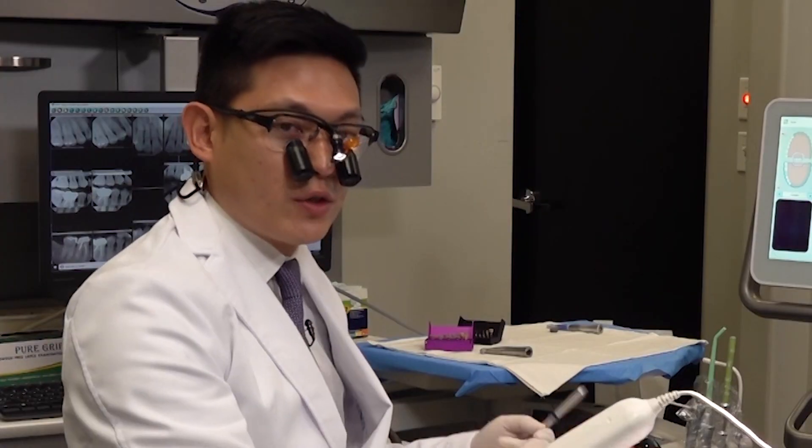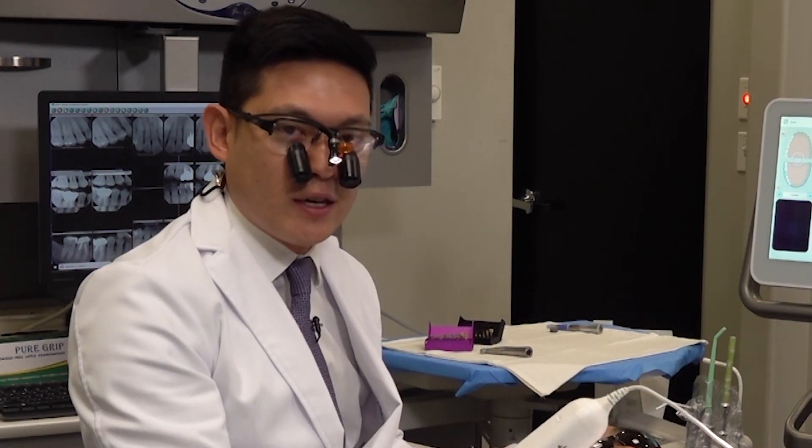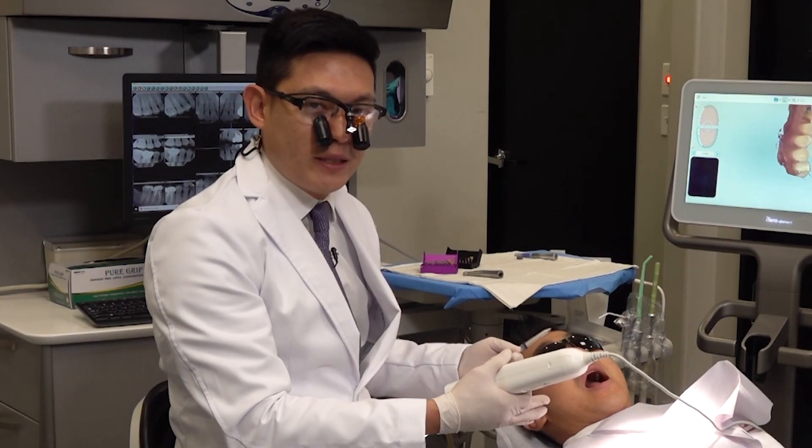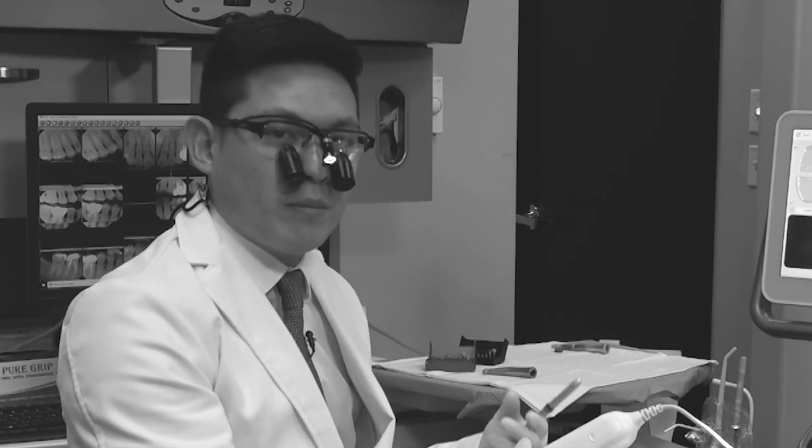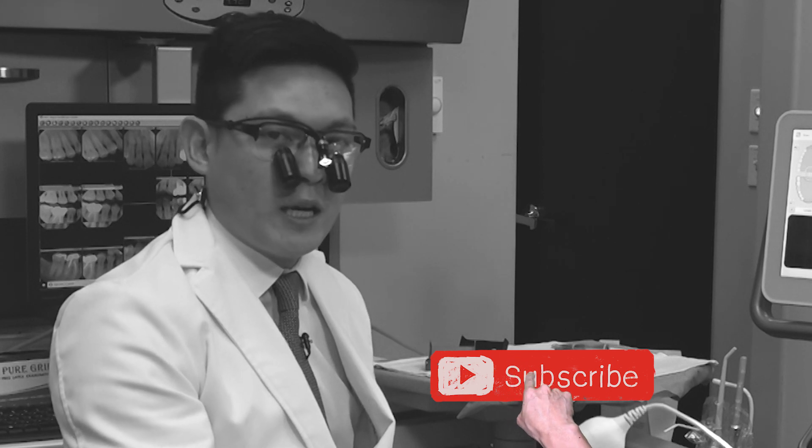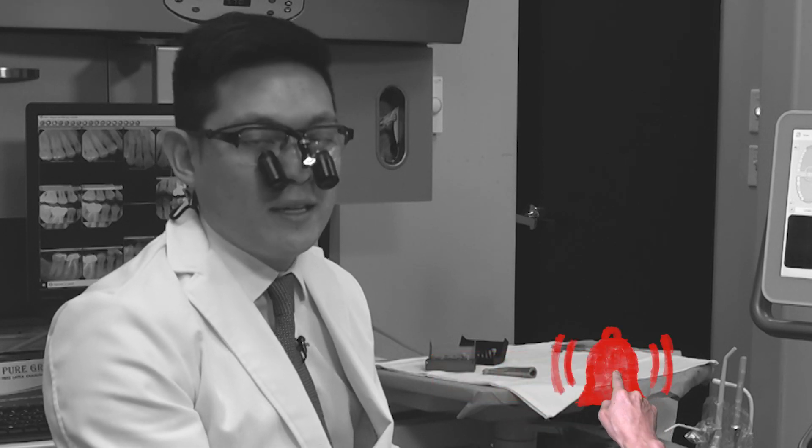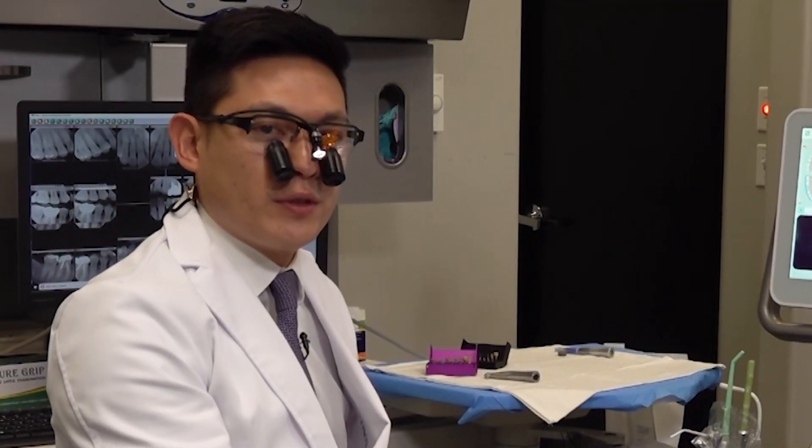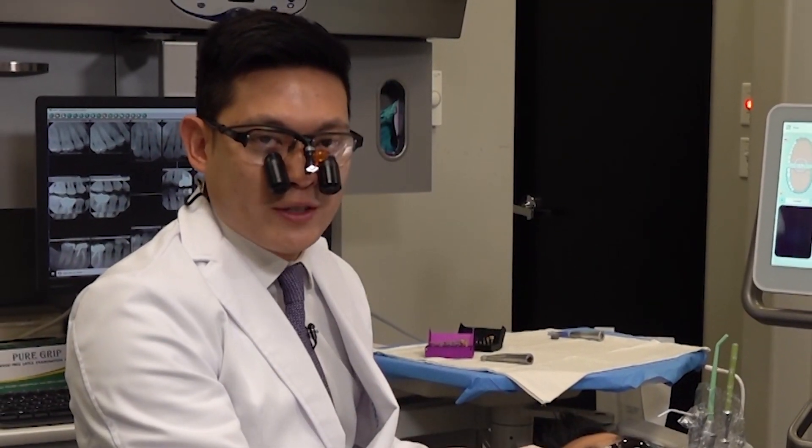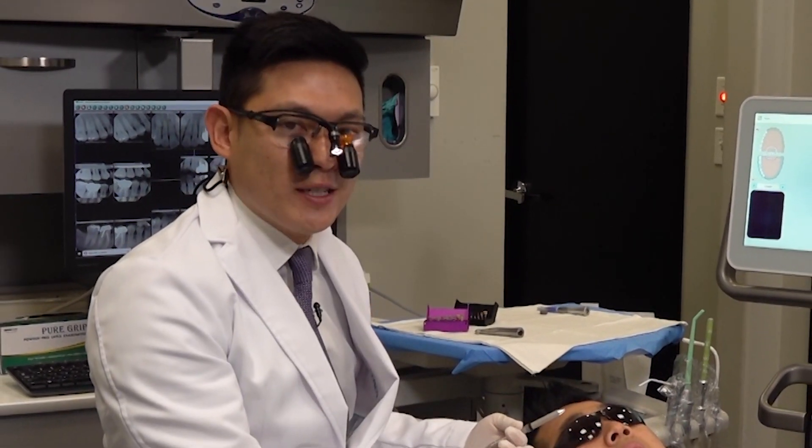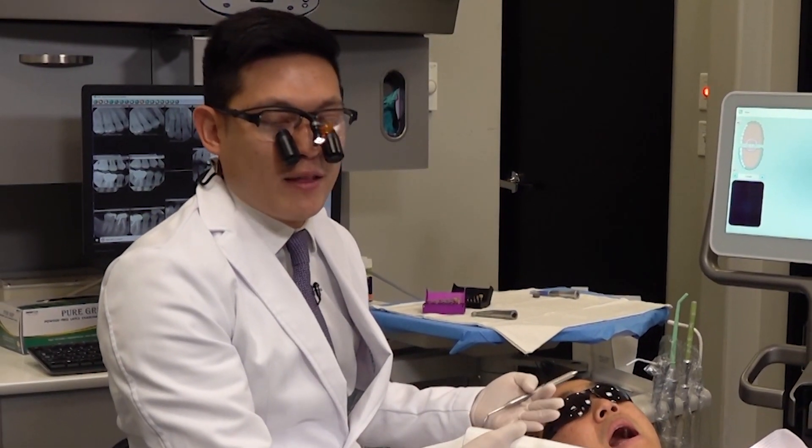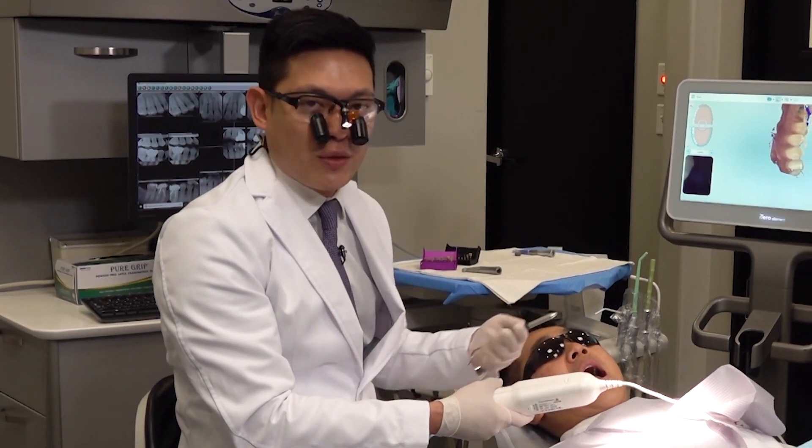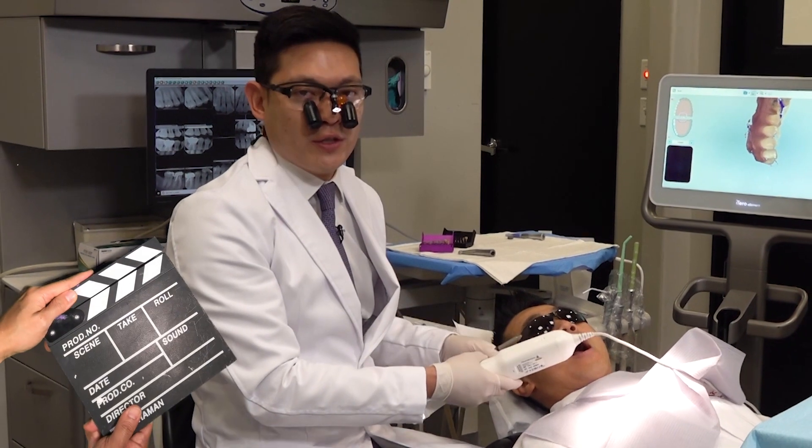The main things here: we started off with suctioning excess saliva, then dried off the adjacent teeth. After that we placed a couple cotton rolls on the lingual vestibule that helps with retraction of the tongue and absorption of any fluids during the scan. If you don't put those absorption aids—the cotton rolls or even a dry angle—there could be saliva that will seep onto the adjacent teeth and prep during the scan, and that could throw off the accuracy of your digital impression.